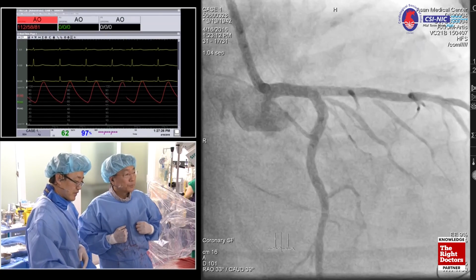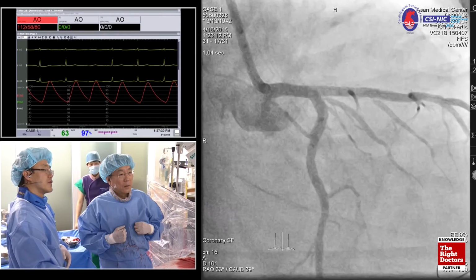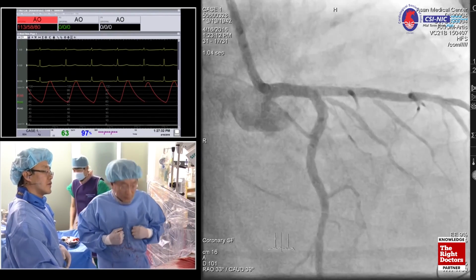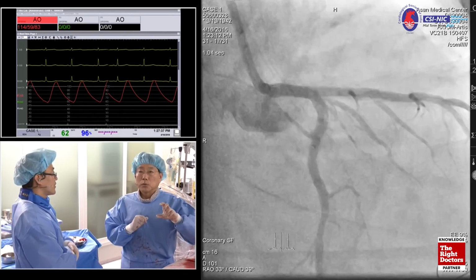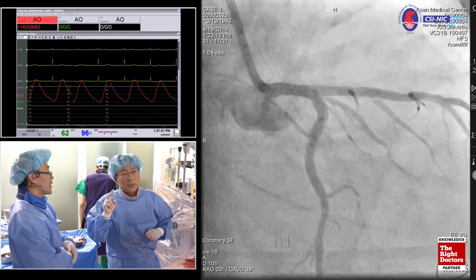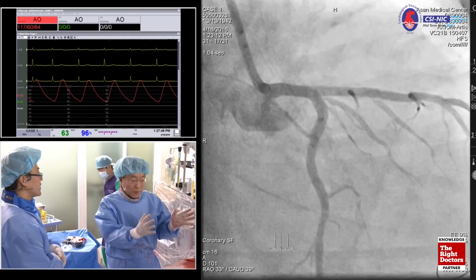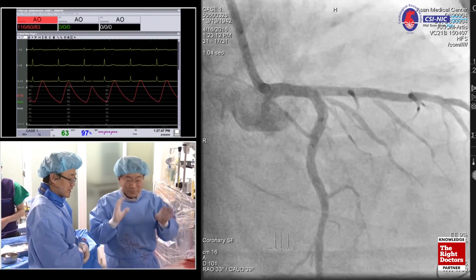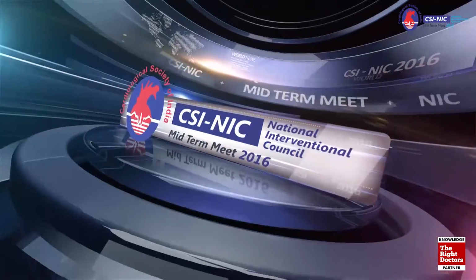Sorry, are you going to do a final IVUS to see the final result? Yes, of course, final IVUS. We're going to do that after the DB, after the drug-eluting balloon, right? Okay, final IVUS. And so we prepare the cases. As another case, we're going to start in another room. Due to very limited time, we want to make more data.